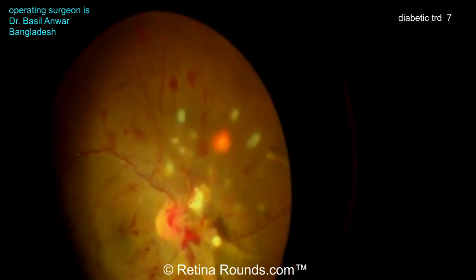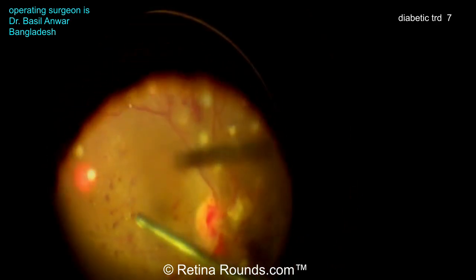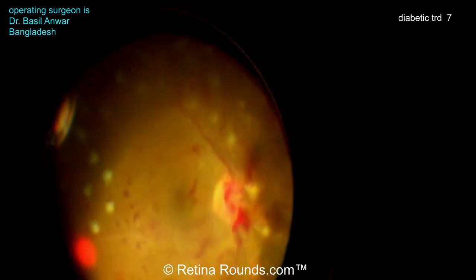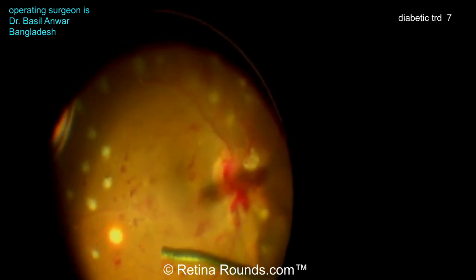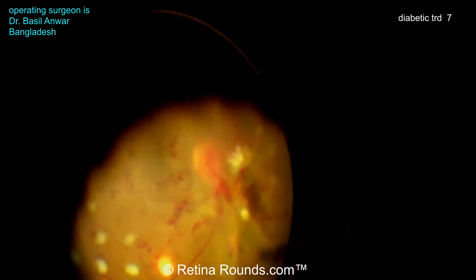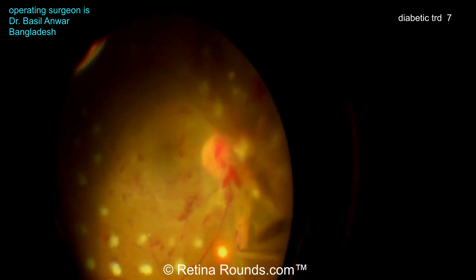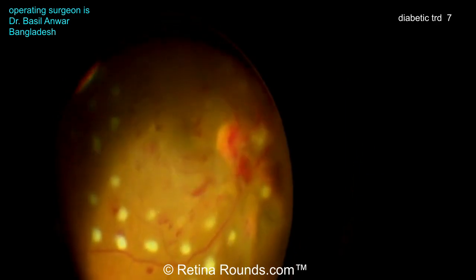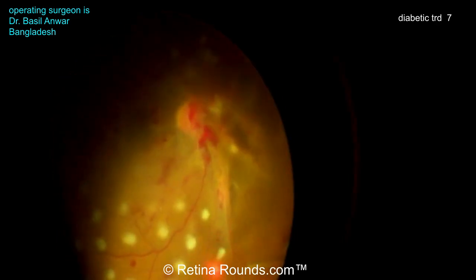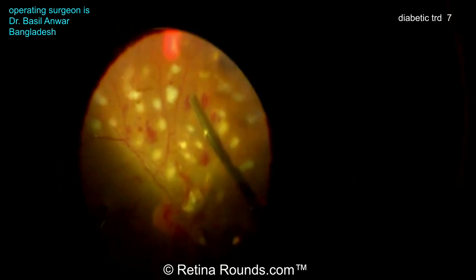Now the bleeding is under control, the membranes have been removed, and Dr. Anwar is applying some PRP. This is obviously a very important step to help prevent ongoing bleeding. Some patients may also benefit from getting an anti-VEGF injection at the end of surgery. PRP really is an important step here to get this disease to a quiescent state and help decrease the chance for more proliferations and more bleeding. I tend to stay outside of the major vascular arcades when doing PRP, and like to go as anteriorly as possible. My burns tend to be just a bit less hot white than these, but Dr. Anwar is really demonstrating this very nicely.